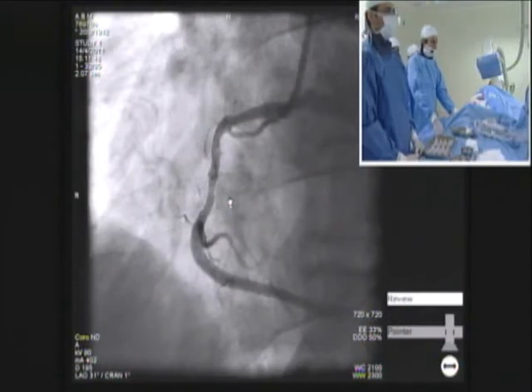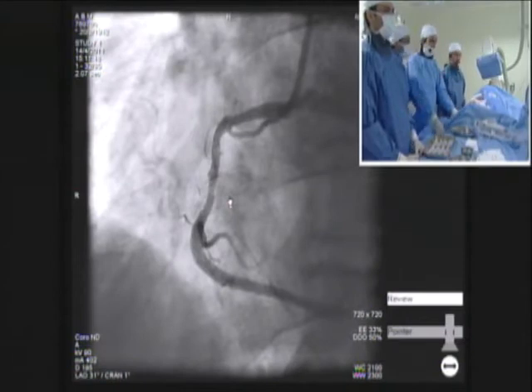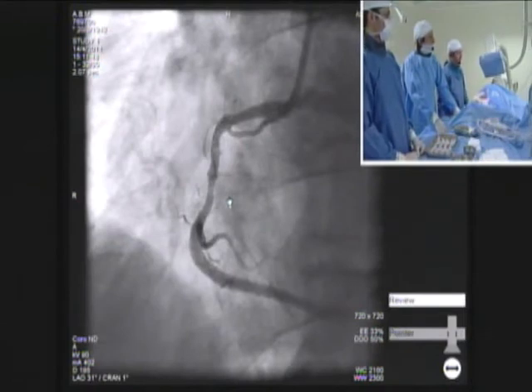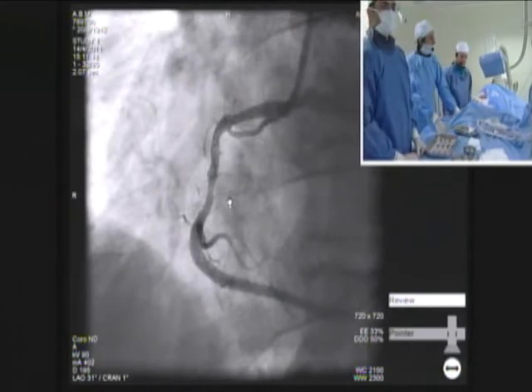Okay, Alex. Yeah, I think, Alex, we've given you all the options here, and I think there are different ways to look at that. Okay, I think the next question that we should discuss in this case is the bifurcation. How do you approach this bifurcation? I saw that you wired both of them, but then you have all those options, provisional, different techniques of bifurcation. What did you select, Alex, and why?